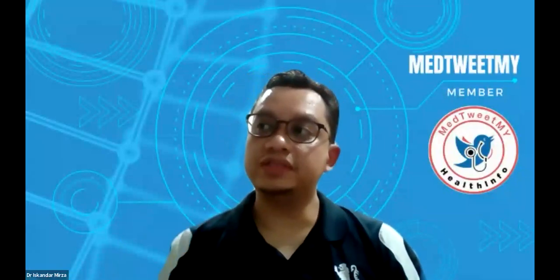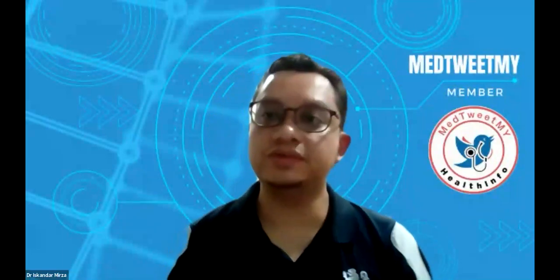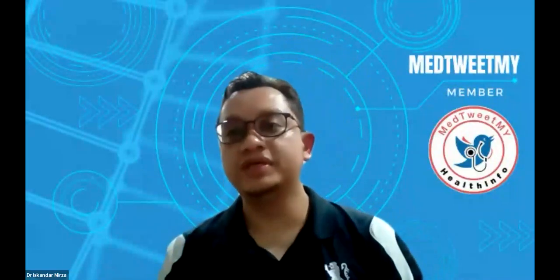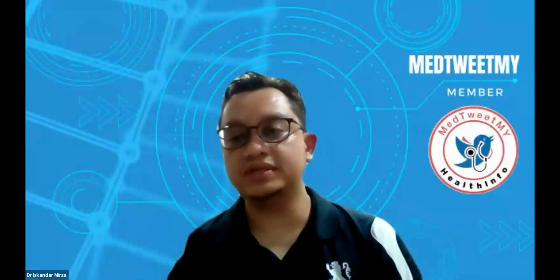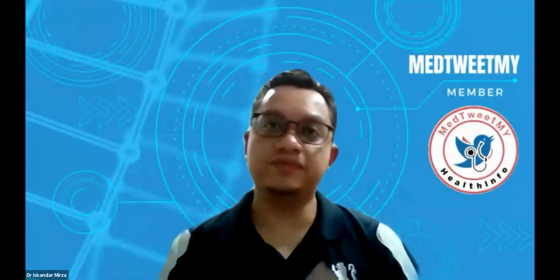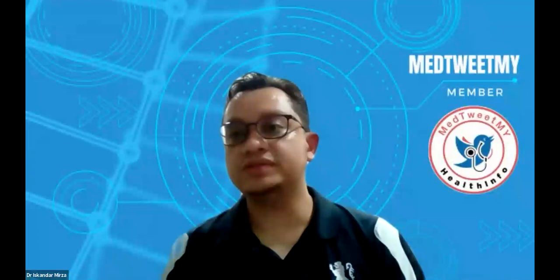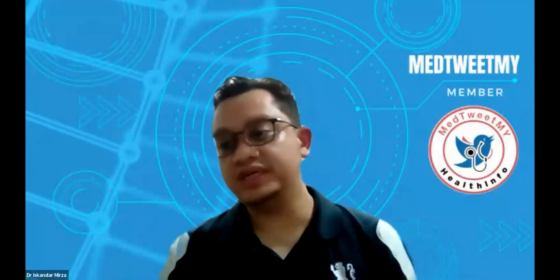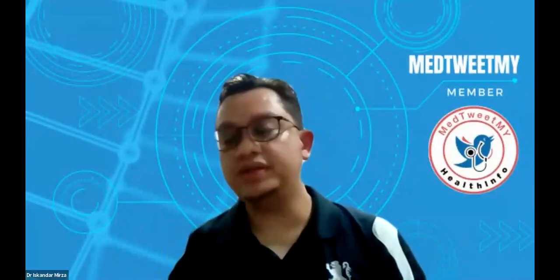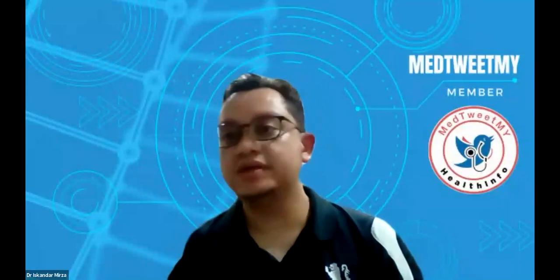So for healthy people, we don't say healthy lah. Mostly people who come to us actually are not healthy. They know that they have some problems, that's why they need to do the assessment. So sometimes, if you come for the medical checkup, usually we routinely do it so that we just want to know that if it is negative, then you can just repeat it after 2 or 3 years, depending on your age and also your comorbidities.